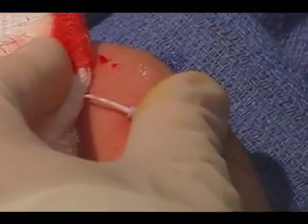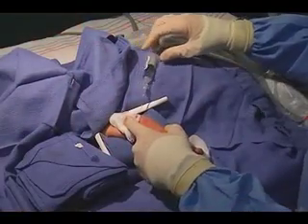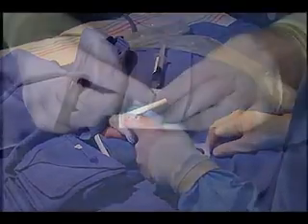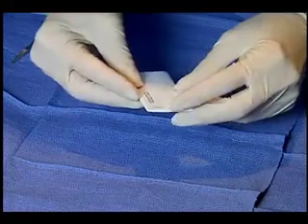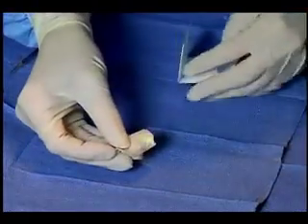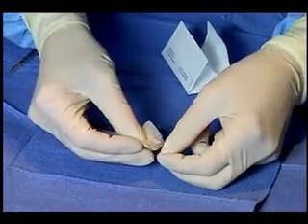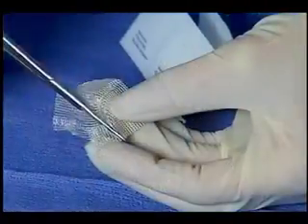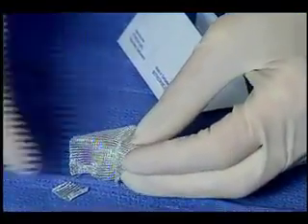Bleeding at the insertion site of the neonatal PICC may not subside with pressure held at the puncture site or may resume with efforts to clean and dress the catheter. In these circumstances, apply a sterile surgical hemostat or gauze at the site before the application of the sterile dressing. Assess the site 24 hours after placement and redress as necessary.